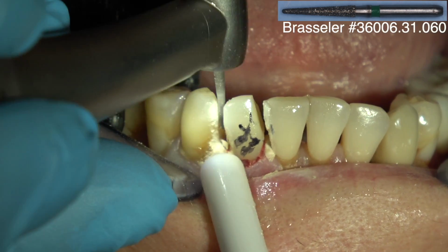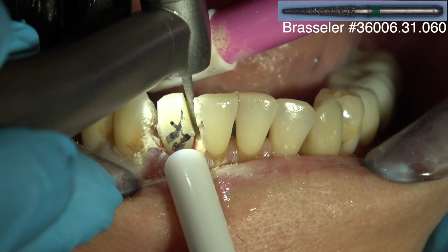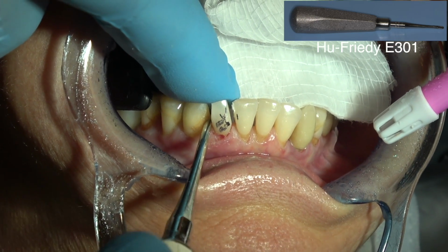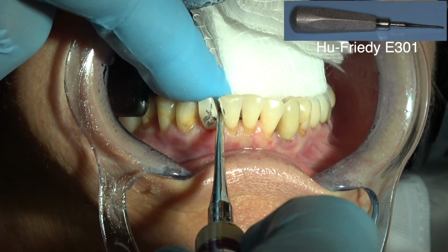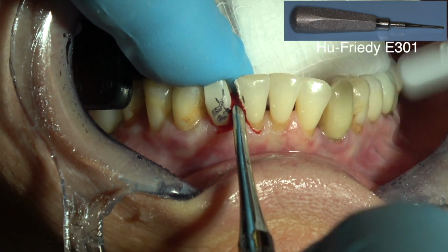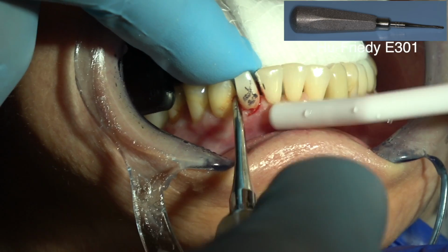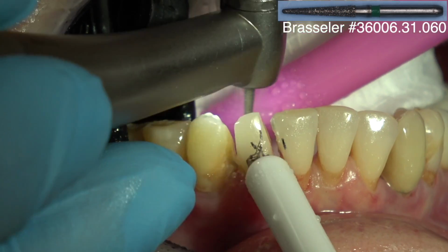So I'm cutting between the adjacent teeth with a thin diamond burr just to create a space that I can elevate. Now, it ended up not removing the tooth, but it did loosen the roots of the tooth in the socket so that I could end up removing it. If you can get a little movement before you try to extract the tooth, that's always helpful. I rarely try to extract a tooth without first trying to elevate it mesial and distal.